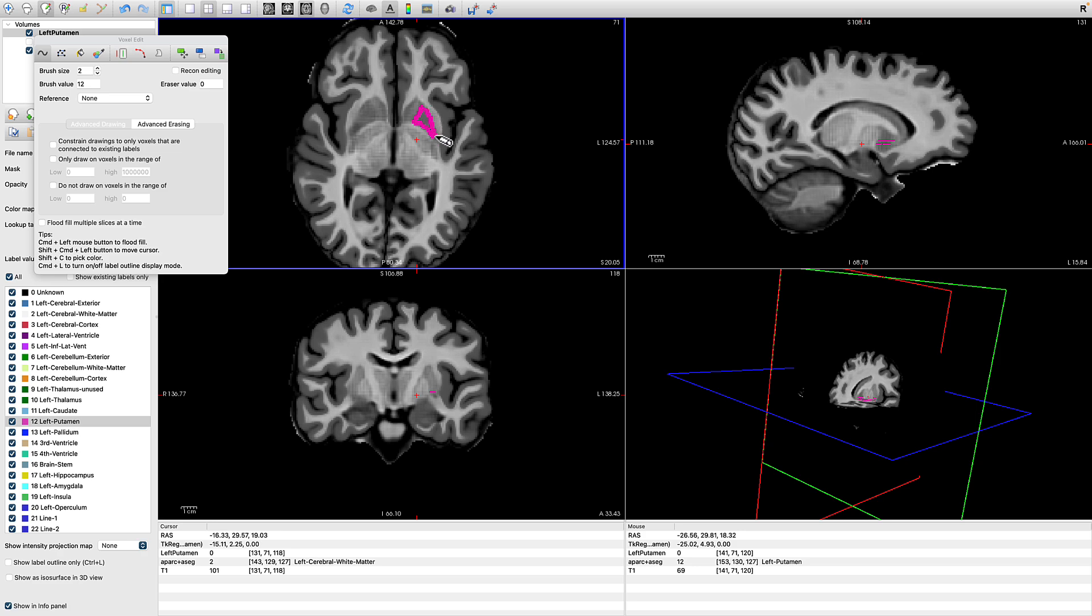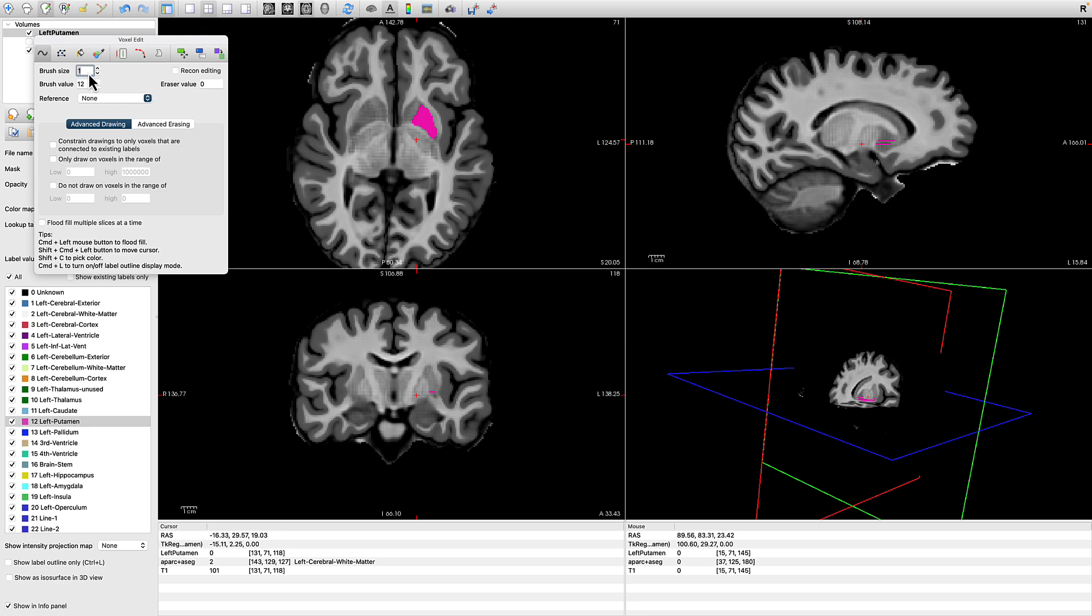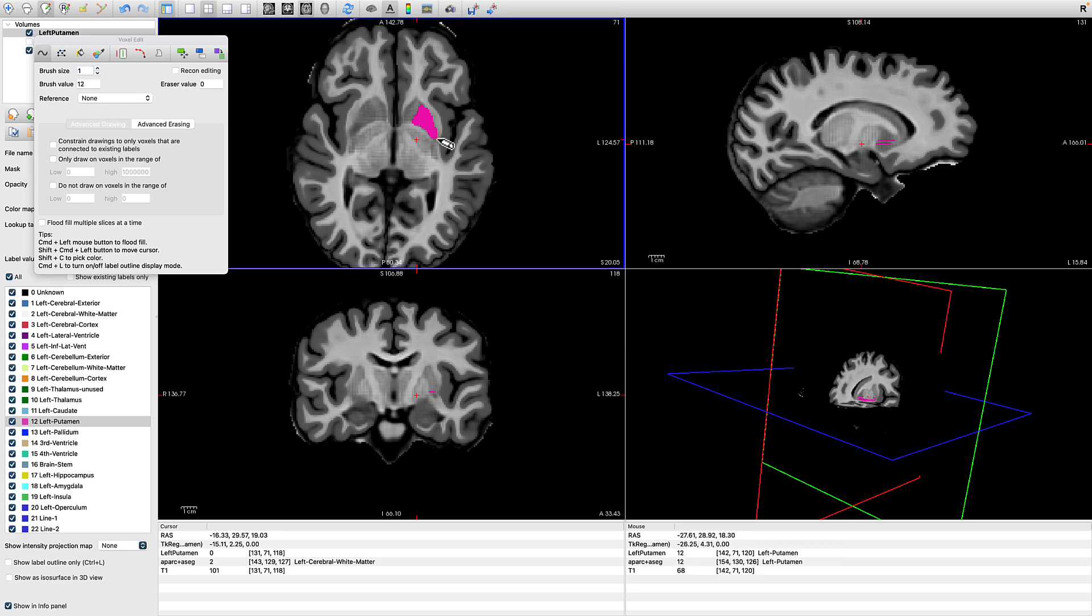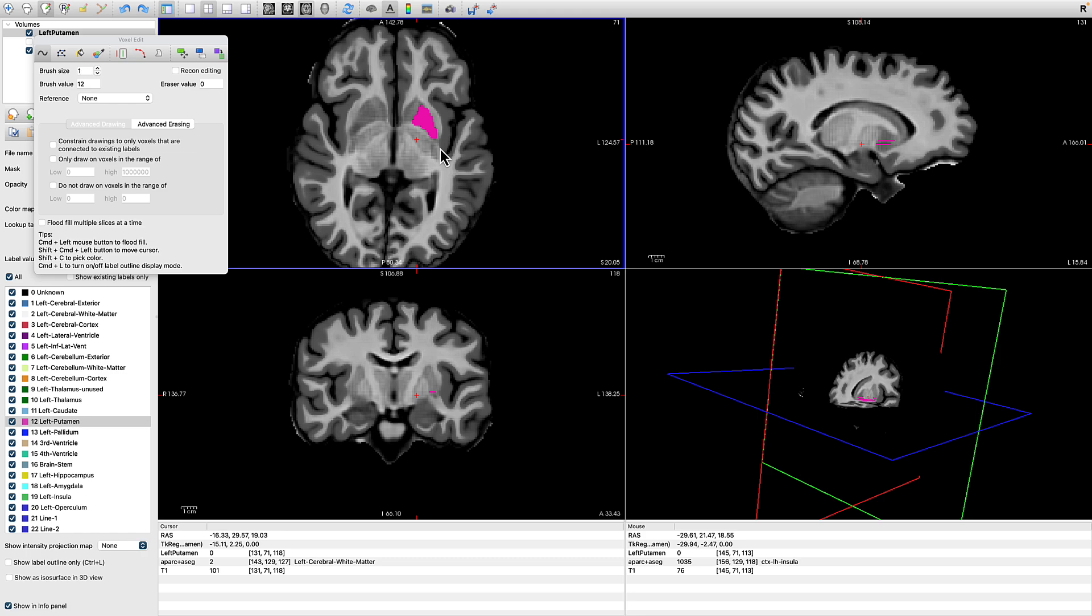Now you can use the up and down arrows to go between different slices. And if you need to, you can change the brush size to make more fine tuned adjustments. Now, if you make a mistake, you can hold down command then Z on a Mac to remove the last stroke. Or you can hold down shift and left click to remove any voxels that you drew.